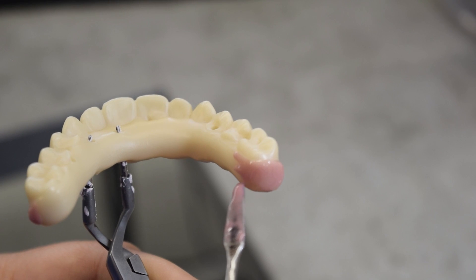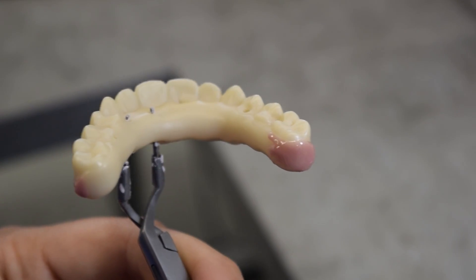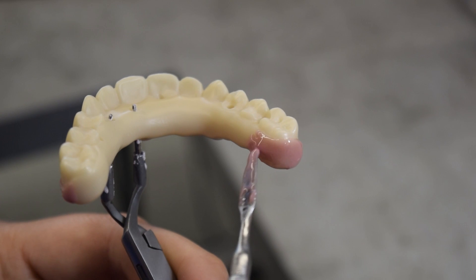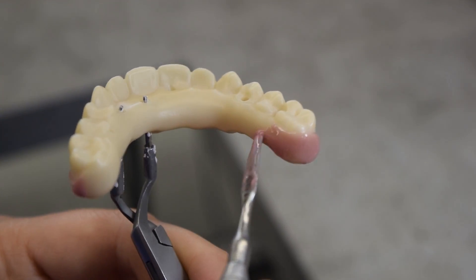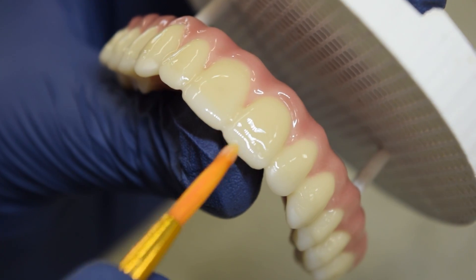Now, all that's left is to finish. Two coats of stain are added to the gingiva, while two types of glaze are used on the teeth. Each coat of stain and glaze requires the arch be sintered to bond the stain to the zirconia, leaving a smooth, continuous finish.